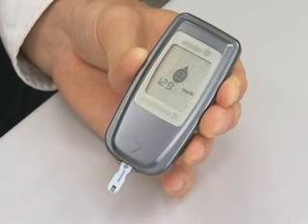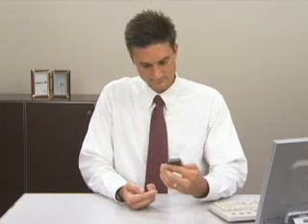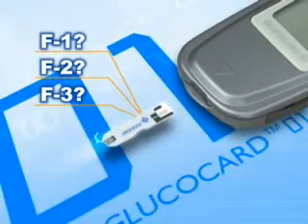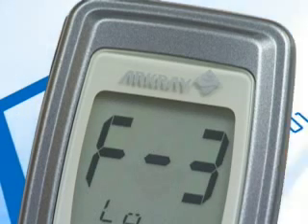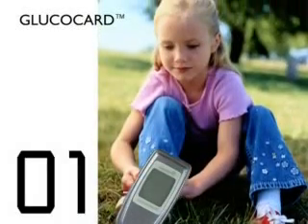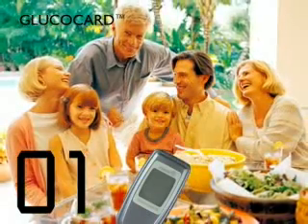Glucocard 01 is easy to use. There's no coding. There's no need to input a lock number anymore. The batch code is automatically selected when you insert a test strip. Simple operation lets anyone easily measure their blood glucose level.